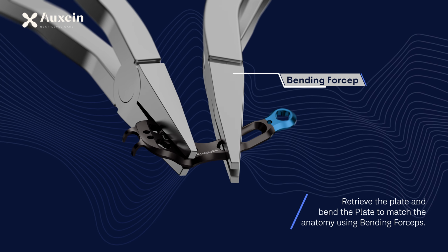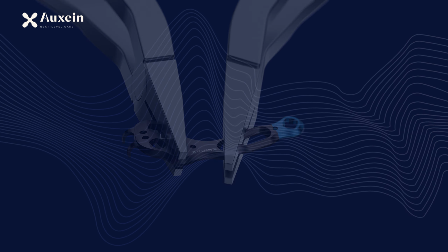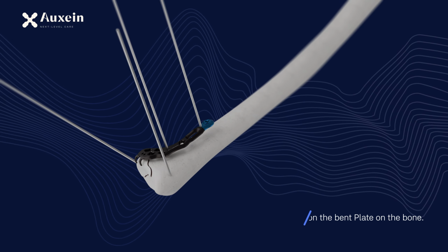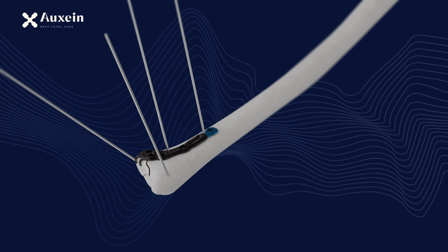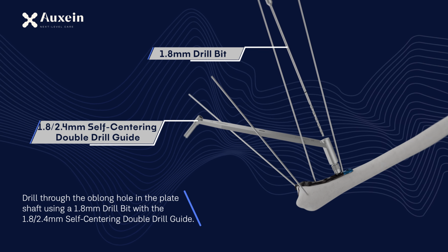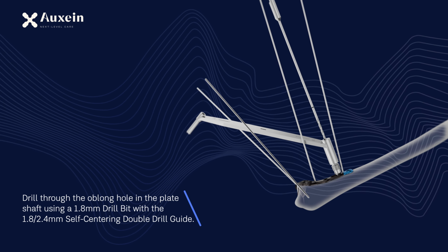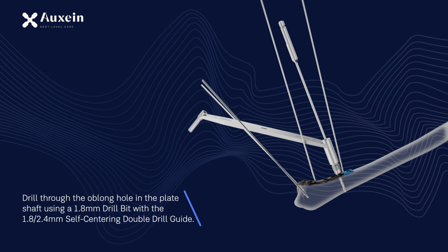Retrieve the plate and bend the plate to match the anatomy using bending forceps. Reposition the bent plate on the bone. Drill through the oblong hole in the plate shaft using a 1.8mm drill bit with the 1.8/2.4mm self-centering double drill guide.